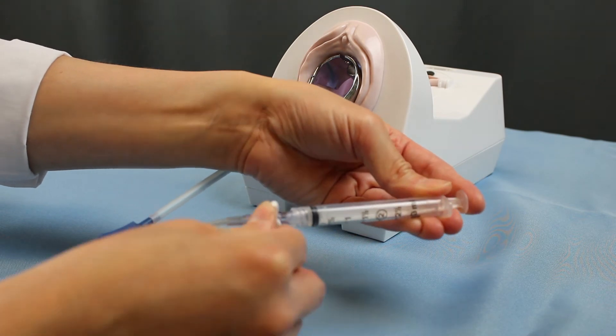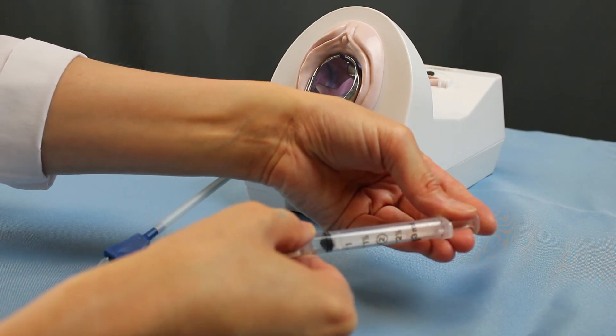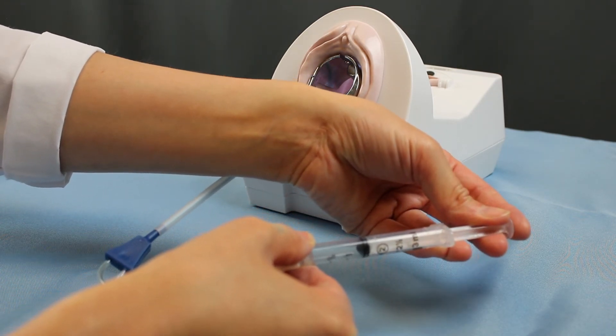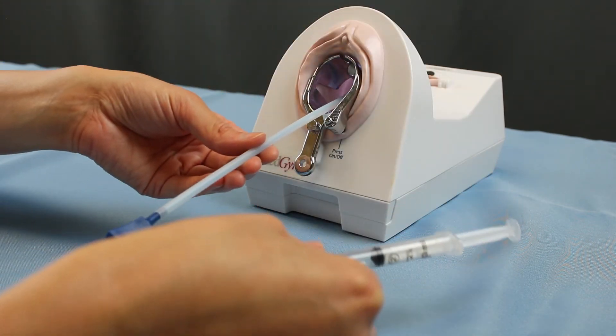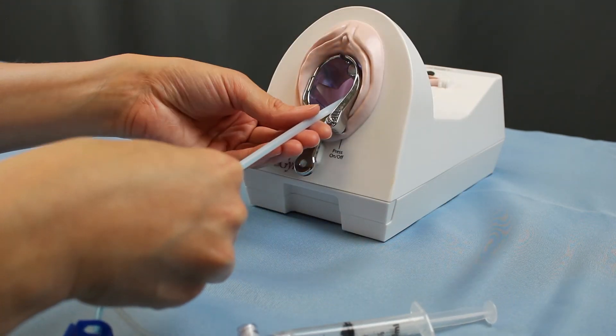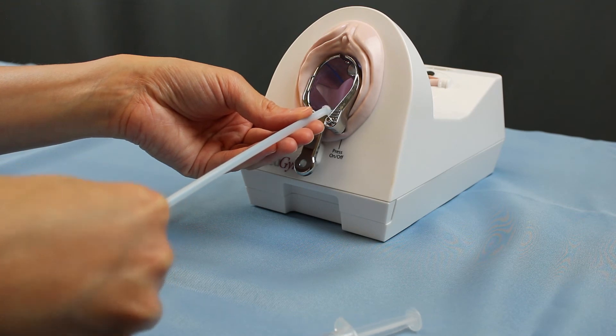After imaging is complete, rotate the stopcock 90 degrees and carefully pull back on the syringe to deflate the balloon. Gently remove the catheter from the patient.